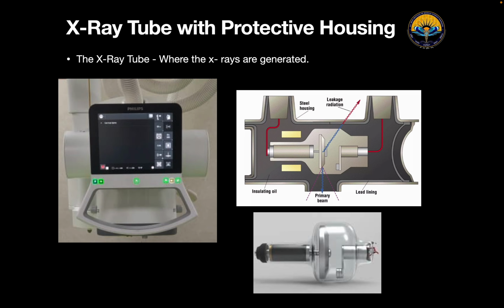This is the X-ray tube which is at our institute, and this is basically a protective covering, or a protective housing, outside. This protective housing will contain a glass enclosure, or glass tube like this, and inside this glass tube we will have a cathode and an anode.